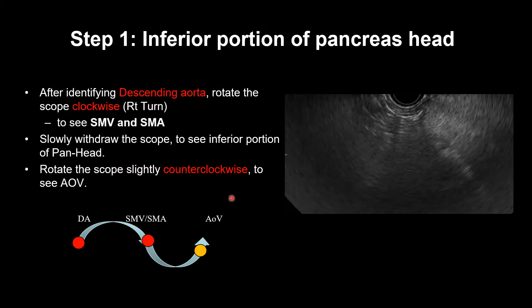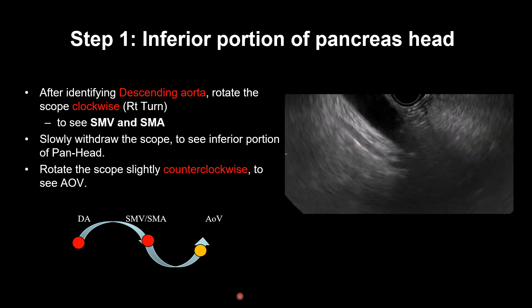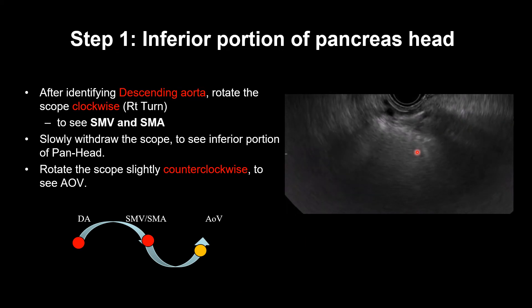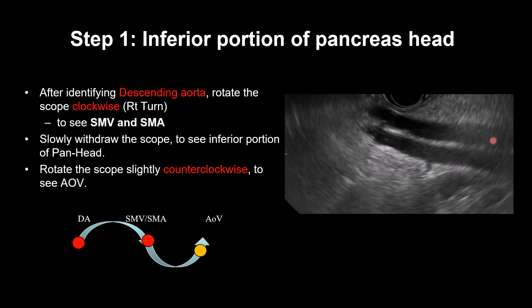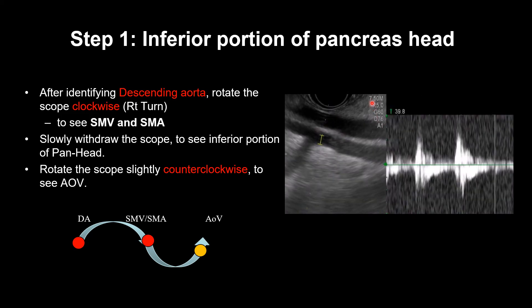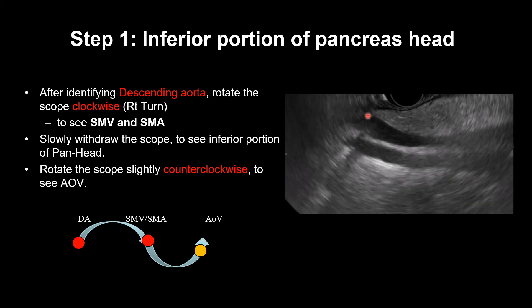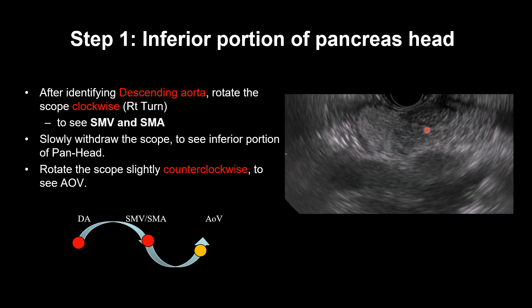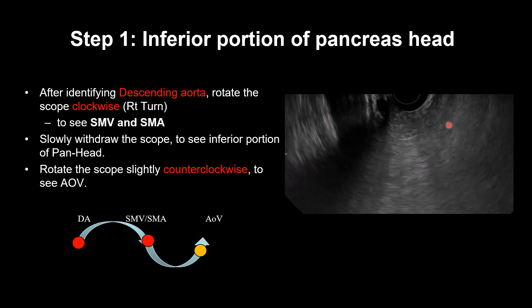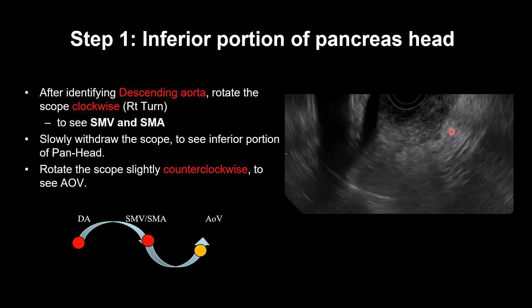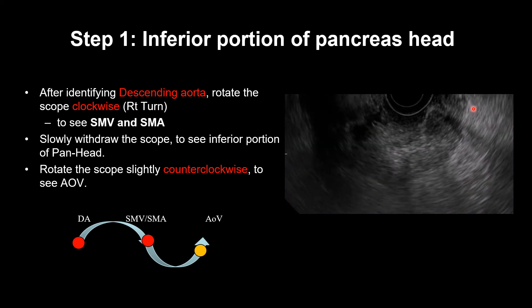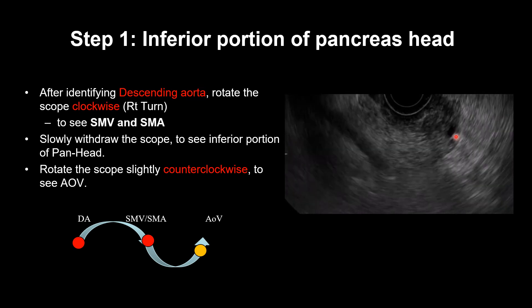Step 1: inferior portion of the pancreatic head. After identifying the descending aorta, rotate the scope clockwise — we can see SMV and SMA. This is the descending aorta. We can see SMV and SMA. This area is the pancreatic head, lower portions. Slowly restore the scope. Rotate the scope slightly counterclockwise — we can see the ampulla of Vater. This duct is the CBD. This duct is the main pancreatic duct.